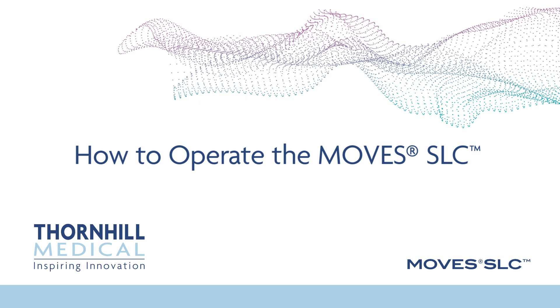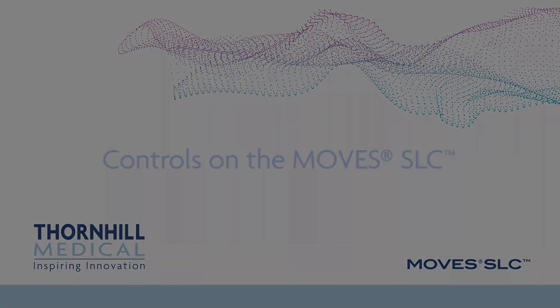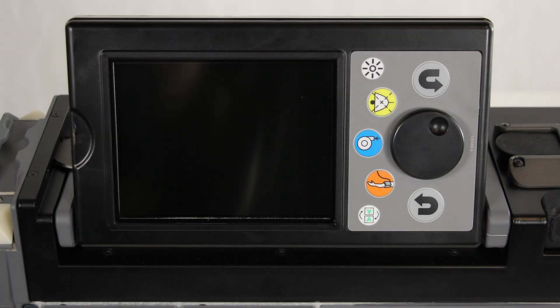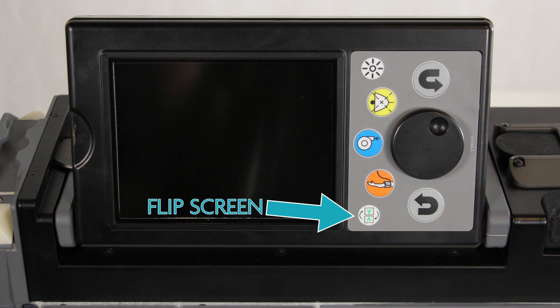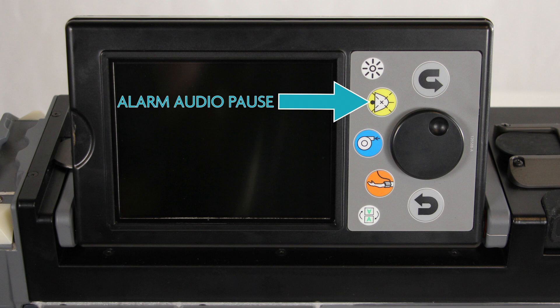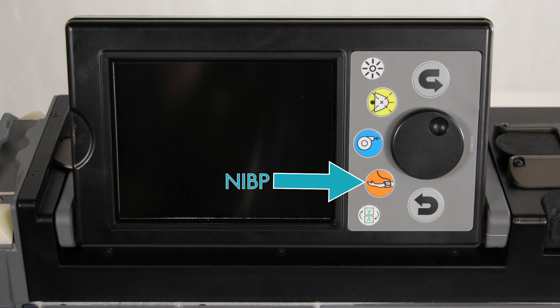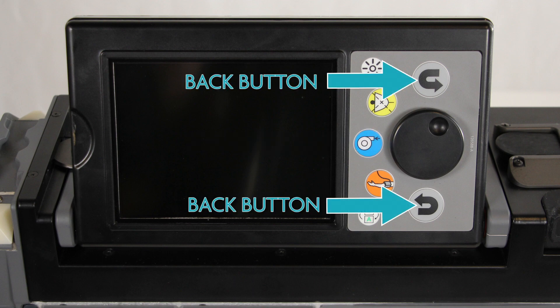How to operate the MOVES SLC. On the navigation keypad, you'll find the following buttons: the screen brightness button to control the brightness of the display; the flip screen button to rotate the information displayed on the screen 180 degrees; the alarm audio pause button to either silence all alarms permanently or temporarily; the non-invasive blood pressure control button to start or stop a non-invasive blood pressure reading; the suction button to start or stop suction; the jog wheel to navigate and make selections; and the back buttons.